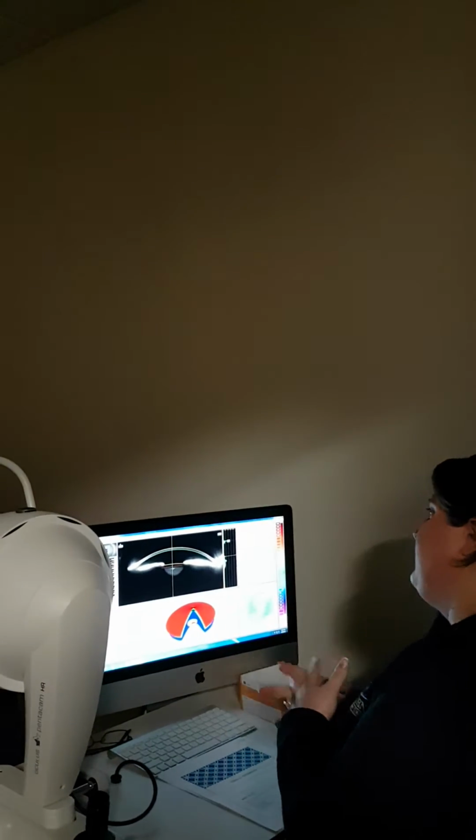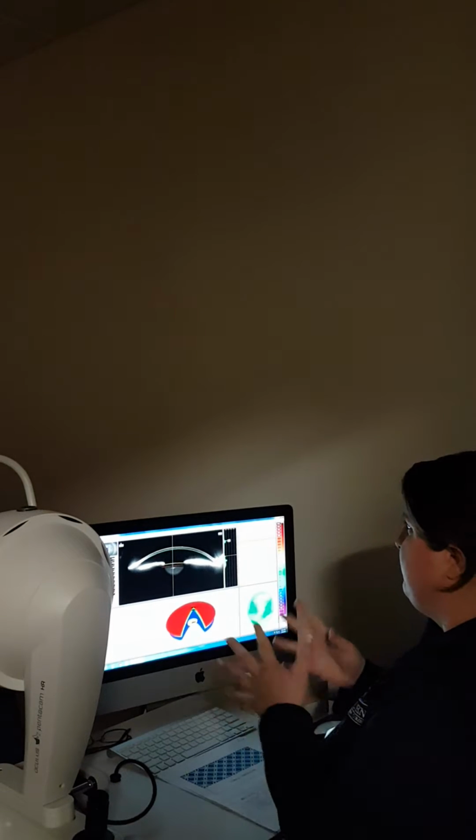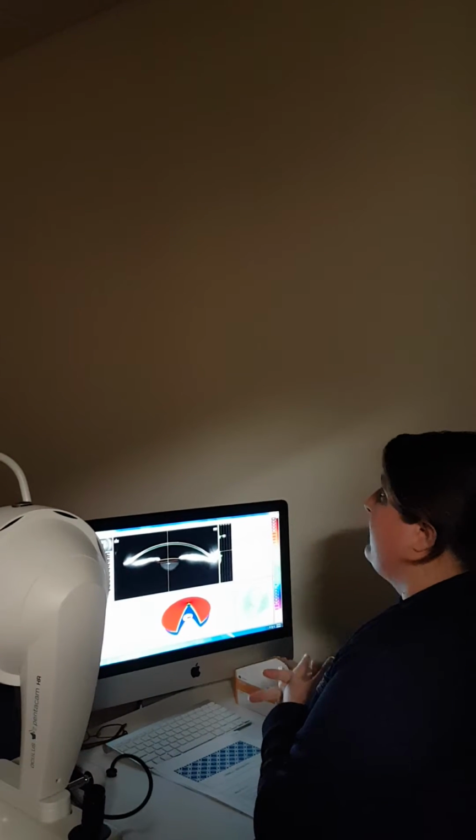I've put artificial tears in, still not working. So I can get an estimate, just getting an idea of how irregular the cornea is, or if it's a PKP patient, is it this way or is it that way? The astigmatism, that gives the doctor something to go on, even if the numbers themselves are not perfect.